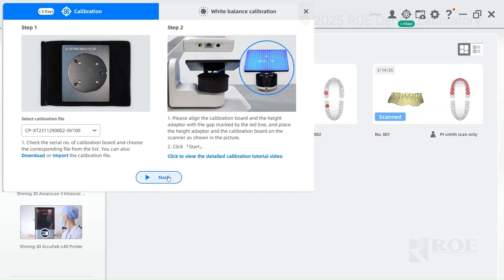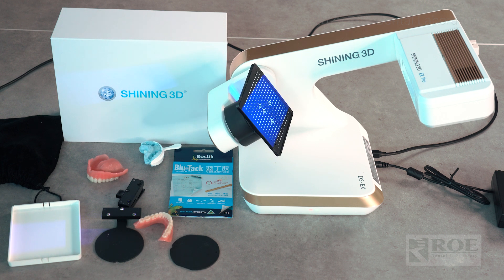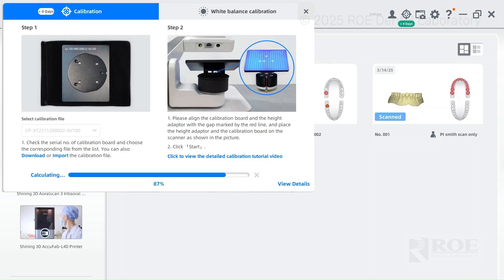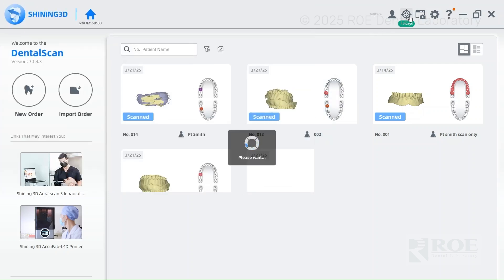Push start. This part of the calibration takes a little longer than the white balance one. The white balance will be very short and sweet. I'm going to fast-forward through this part. The calibration is successful, so you'll X out of the box. We've done one part of the calibration; now we have to go back and do the white balance calibration.